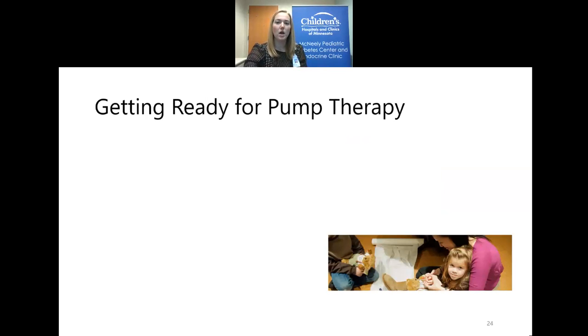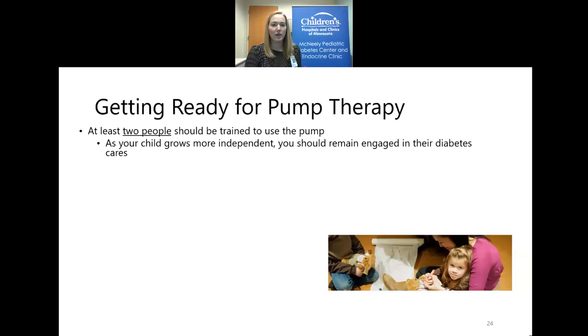I think that's it. All right, so last couple things here. Getting ready for your pump. We always want to have 2 people trained to use the pump. If one person gets trained and something happens to them, well, we're out of luck. So we want 2 people trained at all times. As your child gets older, they're going to become more independent and they're going to want to control that pump themselves. That's great. Independence is fabulous. We want people to grow into their diabetes management.